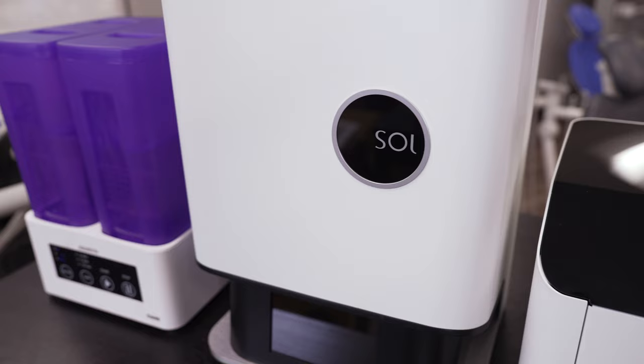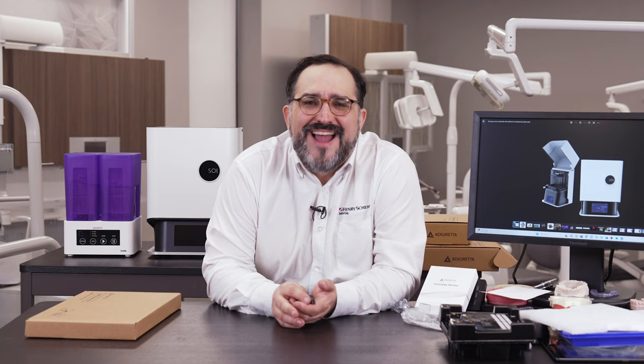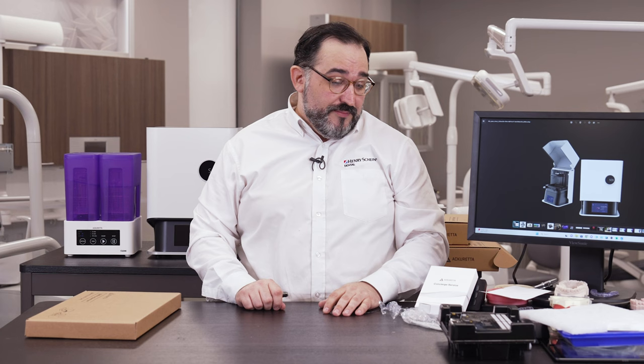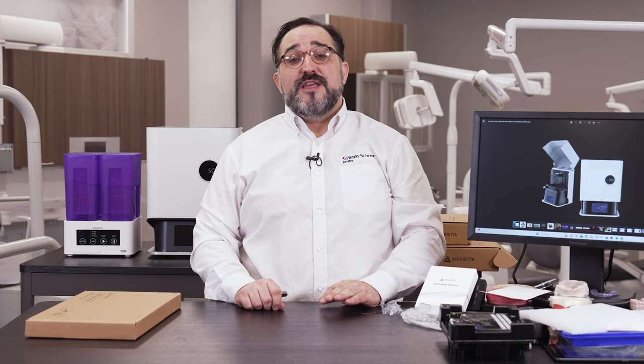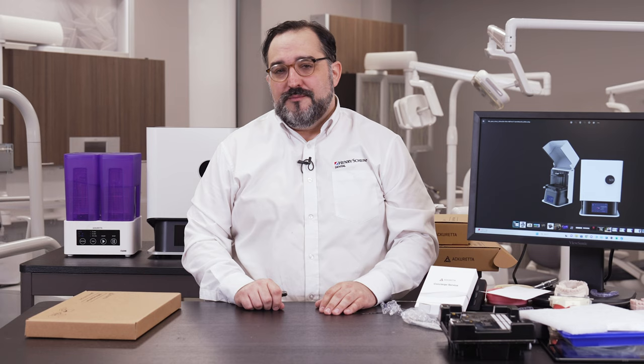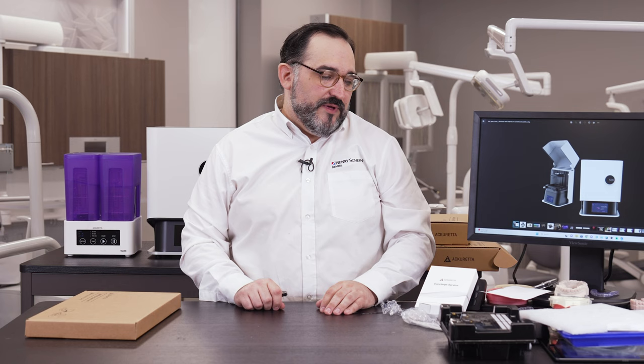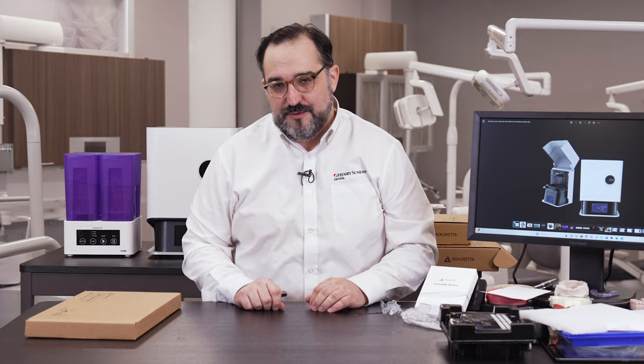If you're a new doctor looking to get into night guards or models, now is the time to get into 3D printing. Jump in with something in this price range — it's very affordable and they provide every tool and resource to get you trained up. It may not do everything, but it's a solid entry-level printer that'll get you from point A to point B. Working with Henry Schein and Acureta means you won't have to go it alone — you can always phone a friend.